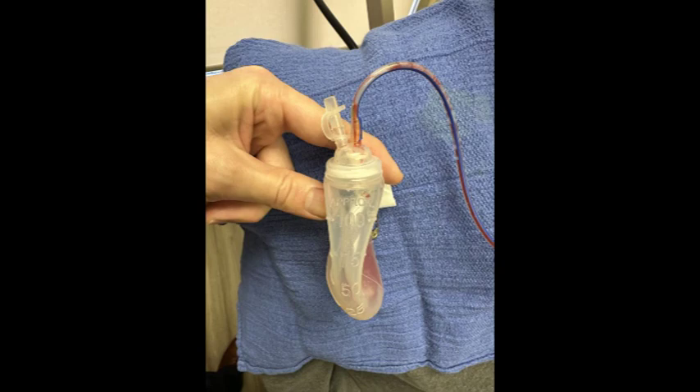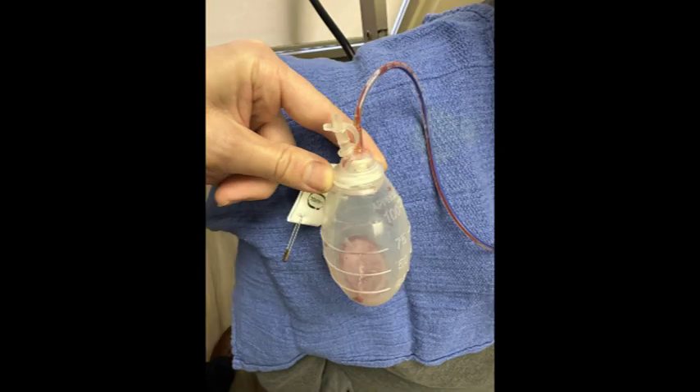Keep in mind that for a drain to work by generating suction it has to be charged. When a bulb is full of air and has a rounded shape it is no longer generating suction. If a charged bulb loses its charge and fills up with air, that indicates the presence of a leak. I hope this helps.